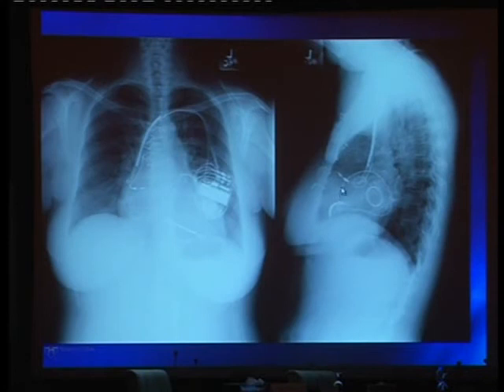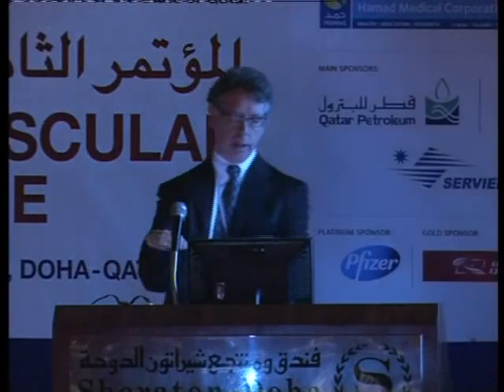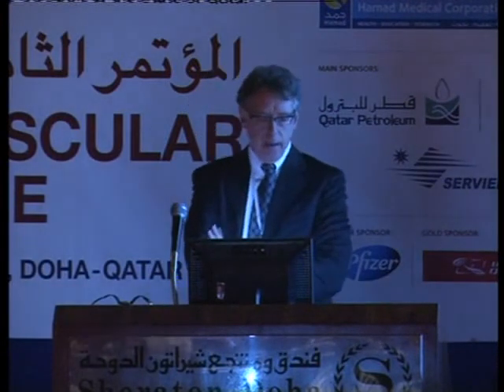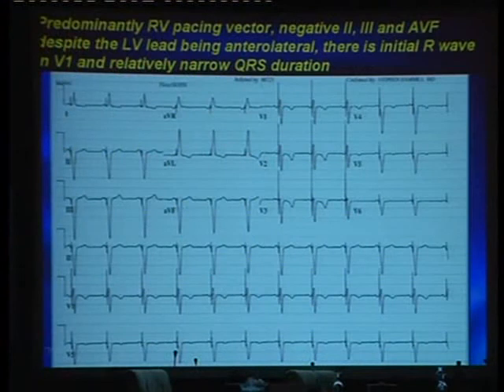So as I said, our approach is to do the substrate, and in contrast, a lot of people think there's kind of a terror of doing a VT ablation, because a lot of them are actually done during VT, in people with already impaired left ventricular function. And of course, when you induce VT, these are very tedious mapping procedures that take a long time. So there's a high likelihood of patients ending up in shock during the procedure.